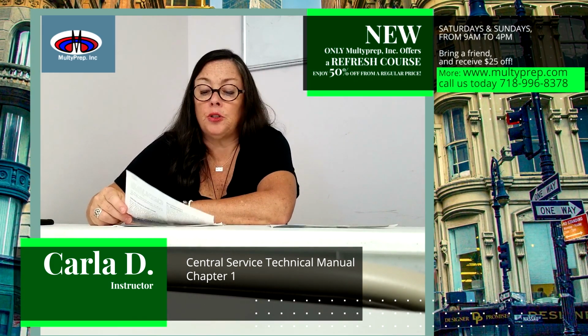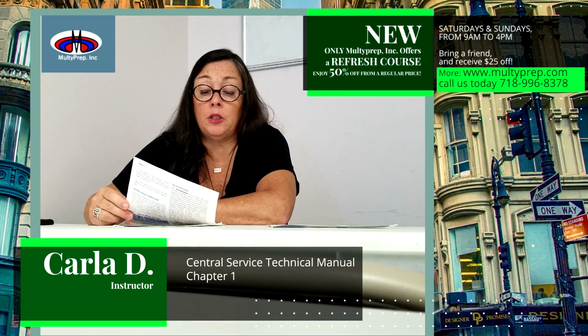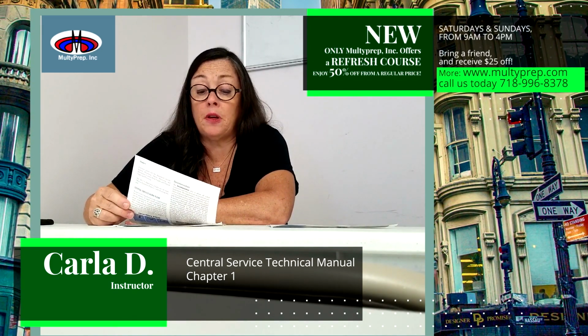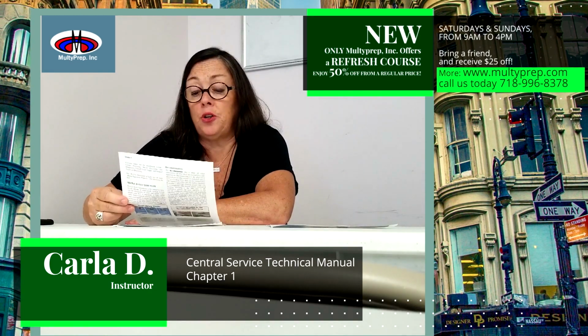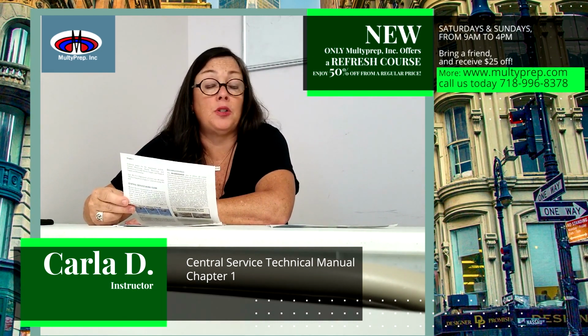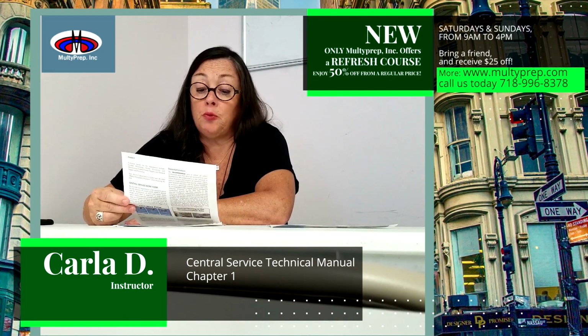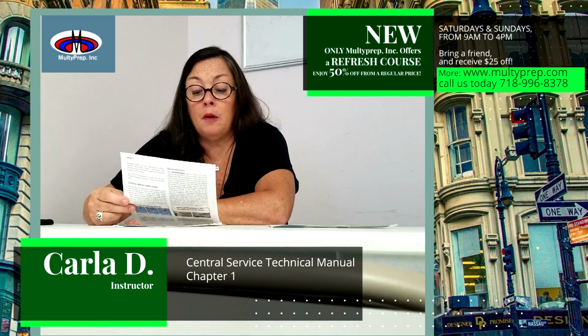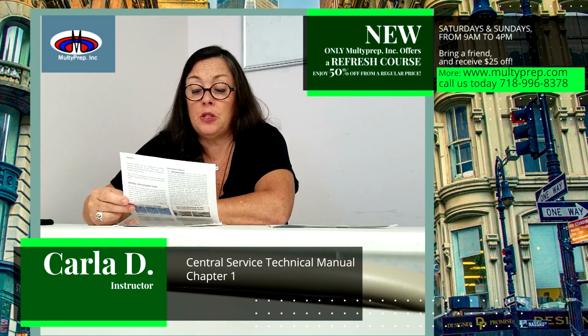The term central in Central Service suggests that services are centralized. Processing soiled goods and sterilizing devices so they are ready for the next procedure is typically conducted in one centralized location. Many healthcare facilities find an increased demand for processing services, partially as a result of a growing trend, the use of more reusable and more complex medical devices.